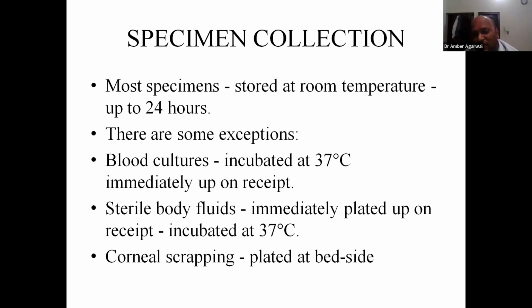What happens is the bacteria will start multiplying, and when you put it in the machine, it will take that as the benchmark and will sometimes give a delayed positive or a false negative result. So if you are using automated systems for blood cultures, you need to keep it at room temperature, and as soon as possible, you need to put it in your automated blood culture system.